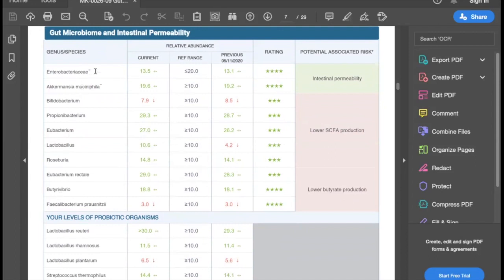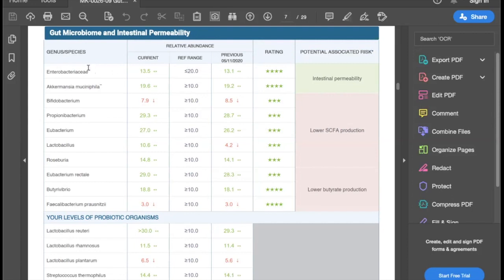You're going to have the microbes listed on the far left column — they're either going to be genus level or species level. You'll see the current level measurements as well as the reference range, and anything out of range is going to be red, with an arrow denoting whether it is too high or too low. The star rating indicates how strong the connection is between a microbe and its associated risk in the right column, based on available research. For example, Enterobacteriaceae has a very strong correlation with intestinal permeability — likely because it is gram negative, produces lipopolysaccharide, and that endotoxin is known to disrupt the barrier and tight junctions. This information can also be found in the GutZoomer guide, a downloadable PDF resource.